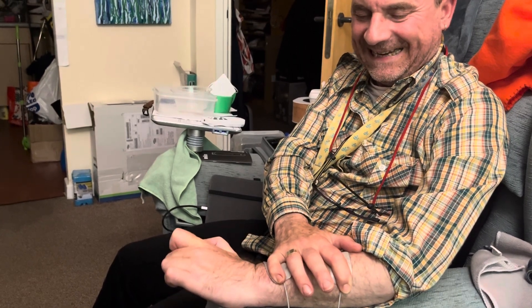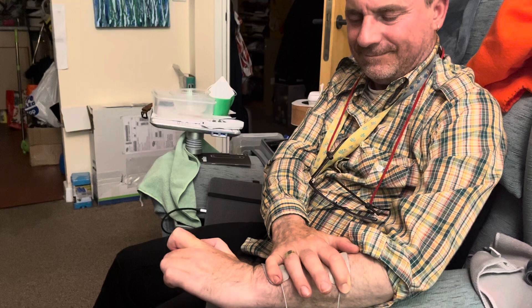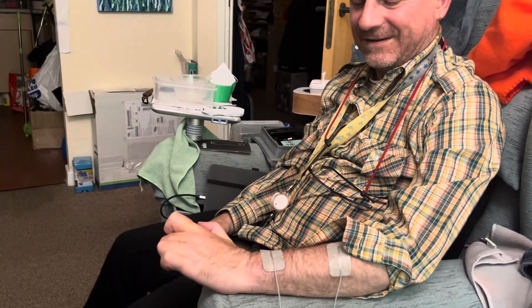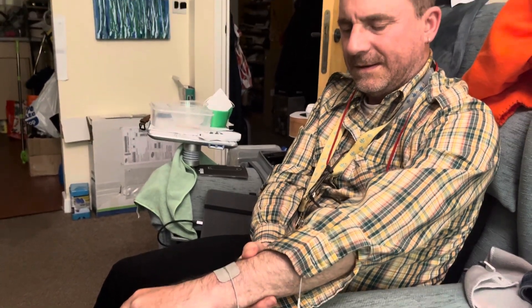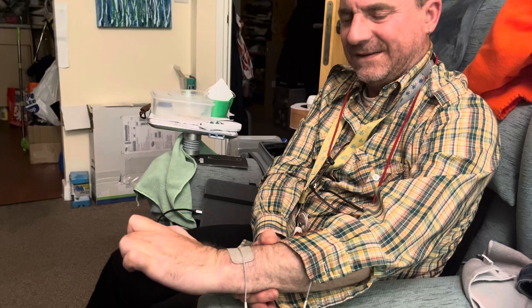There we go again — it feels really, really weird. Apparently it sends signals all the way back up into the brain to remind the brain that the hand's still there. There we go again. It's a very strange sensation. It's not painful in any way, but it's a bit uncomfortable, let's put it that way.